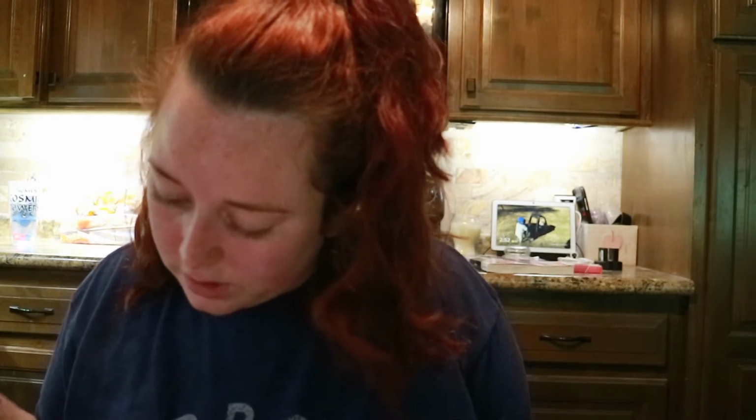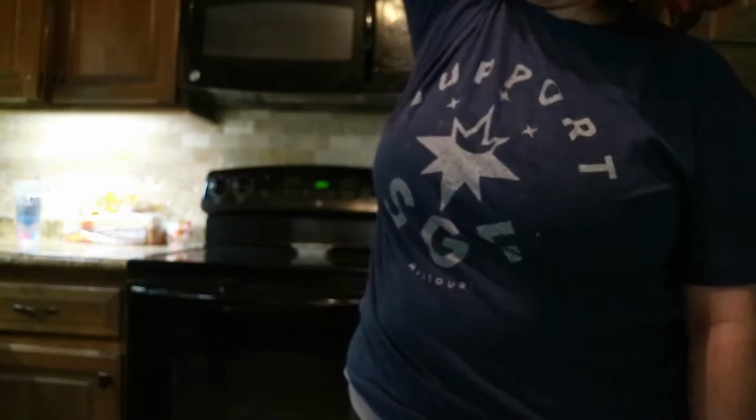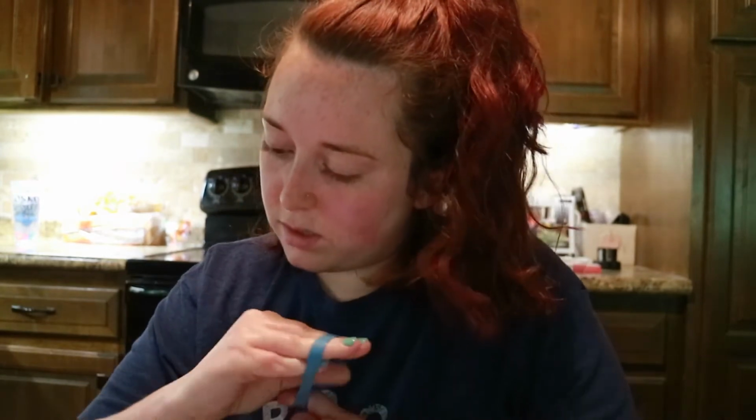Okay, get the blood flowing. Stand up during blood sampling collection. Select the hand you will use, it'll be this one, and rotate the arm in a circular motion multiple times. And, okay, make a fist and open and close it 10 times. 1, 2, 10. Okay. It says, put the tourniquet on your wrist. So it doesn't hold me.